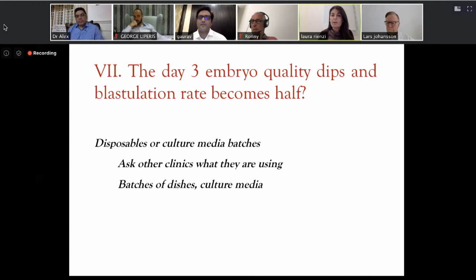But when thinking about artificial light inside the lab, which has been a matter of debate, I think it is really very important, and biologists have to be able to see what they're doing. I find it a little bit funny that I see a lot of laboratories with the lights off, but then the embryos are always exposed to light on the laminar flow or under the microscope. So what is the purpose of taking out the light for embryologists' daily work, when the embryos are outside the incubator under the light, under the microscope?